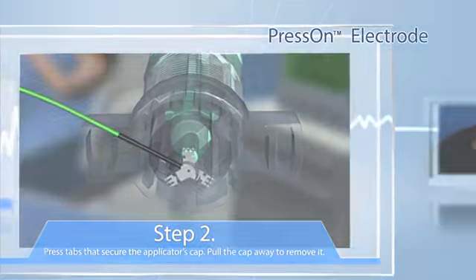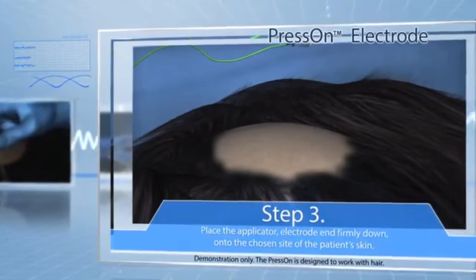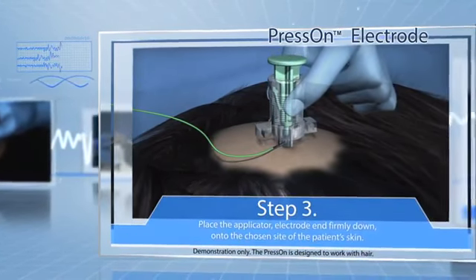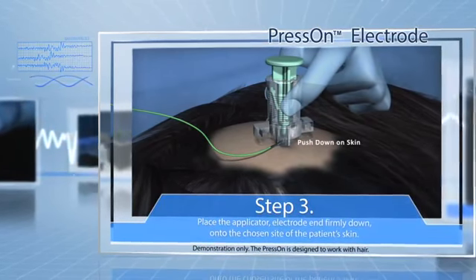Step 3: Without touching the plunger, firmly place the applicator, electrode end down touching the skin, onto the chosen site of the patient.